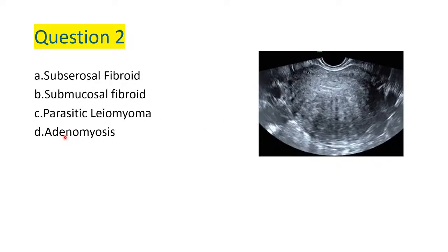So this is adenomyosis. This is one of the manifestations of adenomyosis. It can manifest as a focal thickening like that. Mostly it affects the posterior aspect of the myometrium. So this is focal adenomyosis, and you can see it with the Venetian blind. These hypoechoic lines appearing like streaks of shadows are what we call the Venetian blinds, which is one of the sonographic features of adenomyosis.